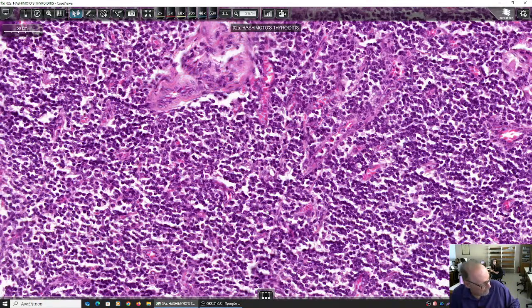They could be B cells, but what other cells could they be, so that we justify the destruction of the follicles? That means they will attack the follicles. They will be cytotoxic cells. So which cells are they likely to be? Yep. Excellent. We have T8 lymphocytes and another subpopulation of lymphocytes attacking cells.